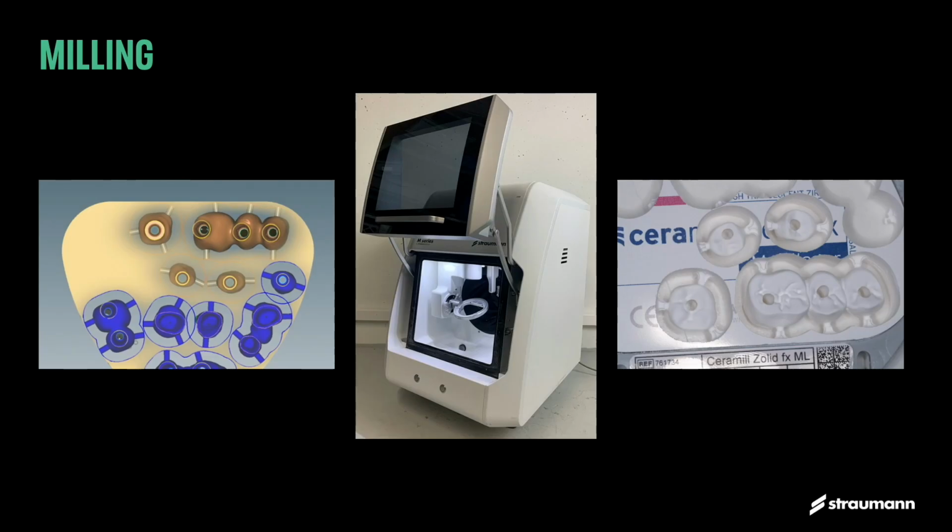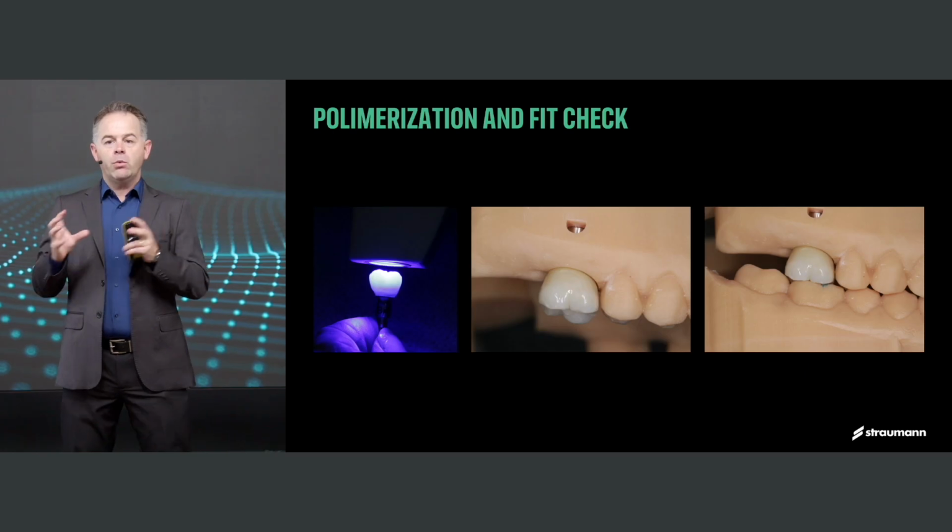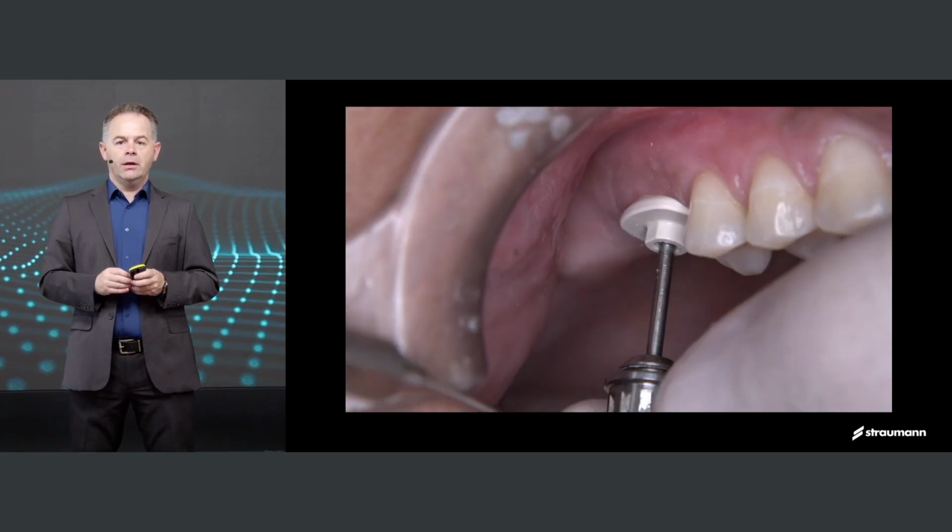As we shift that design to the lab, during scanning, what you also do, you take a picture with your shade palette. In this particular patient it was A2, A3, and A3.5. This was shifted to the lab technician who started doing the artwork of the shading to best match the patient's overall coloring. All the lab work is done. It's time to get real.